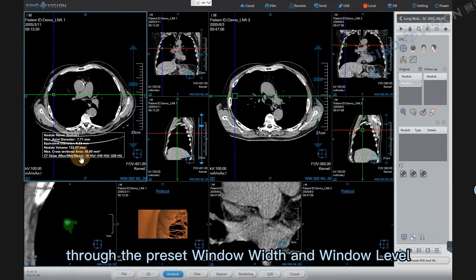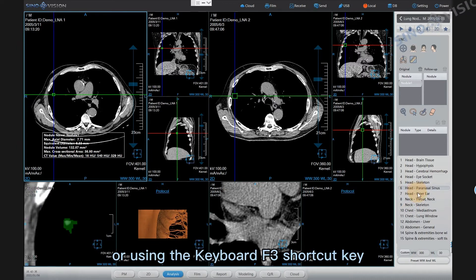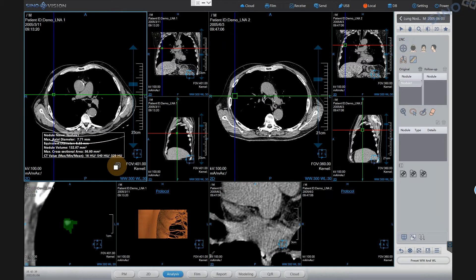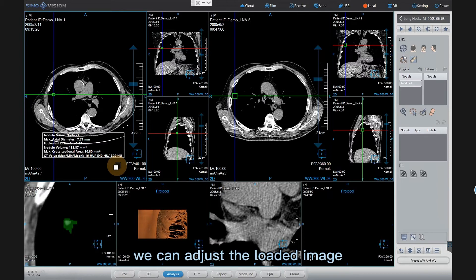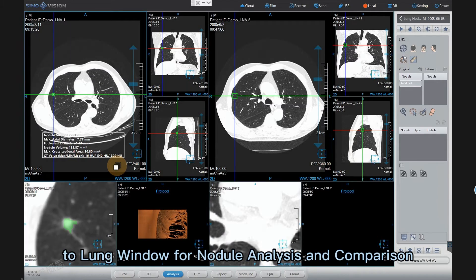Through the preset window width and window level, or using the keyboard F3 shortcut key, we can adjust the loaded image to lung window for nodule analysis and comparison.